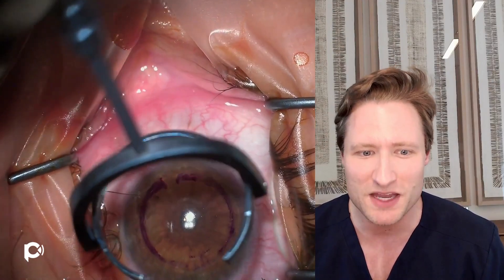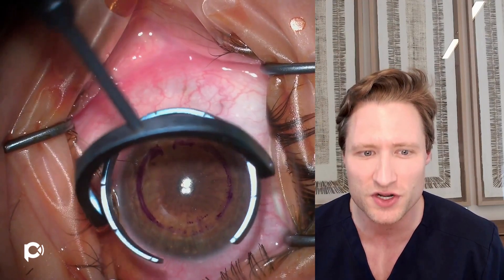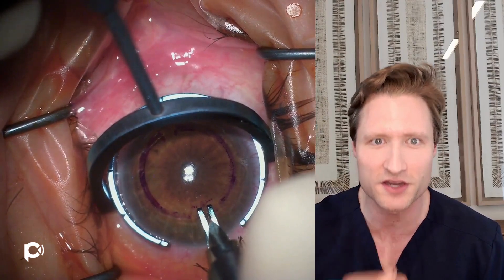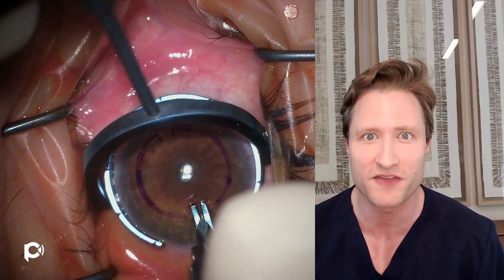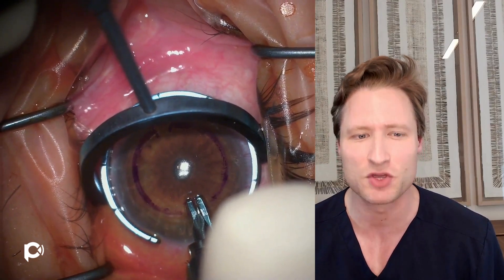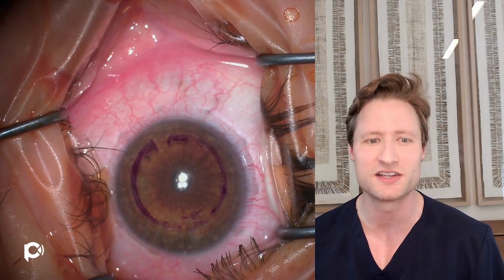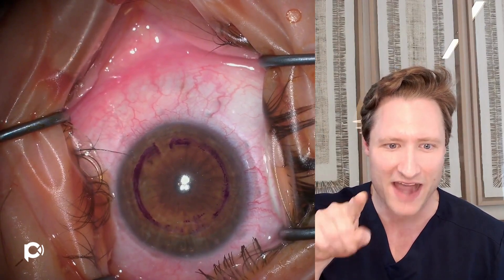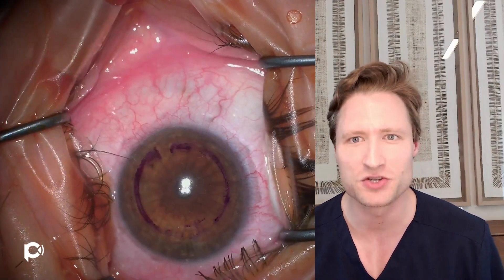This is a diamond blade which I've just calibrated to 60% of the measured thickness of the cornea taken from our Pentacam images. We know the thickness of the cornea temporally, I calculate 60% of that depth, and set the diamond blade accordingly. I'm gripping the eye with a Thornton ring, which provides excellent stability and control. The maneuver is down and back, and that way you know you're at a good 60% of the measured depth.